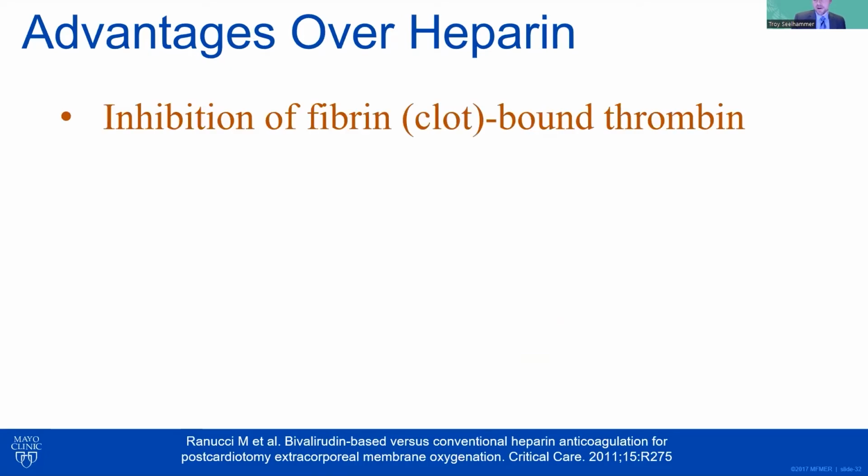Touching on its advantages over heparin, I think one of the most important things is this ability, as I alluded to earlier, of acting at sites of clots. All patients on sustained periods of mechanical circulatory support will have laydown on their circuit. It typically occurs at points of turbulence within the blood flow path as it moves through the extracorporeal circuit. There's often laydown on the oxygenator and the post-oxygenator faceplates and in the tubing itself, particularly if there's acute angulation or stenosis in your cannula tubing. That turbulence activates primary and secondary hemostasis. Once that deposition occurs with heparin-based therapy, it causes further clot propagation.